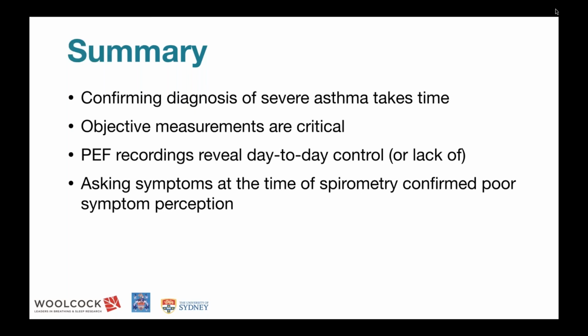But it's useful, particularly in the initial assessment phase and when you're trying to gain control and when there are difficulties in managing a person's asthma. Asking symptoms at the time of spirometry and matching it to the peak flow recordings are, I wouldn't say just very important. I think it's a critical part of the assessment of that particular individual's asthma.